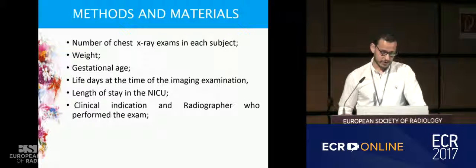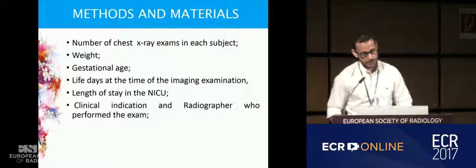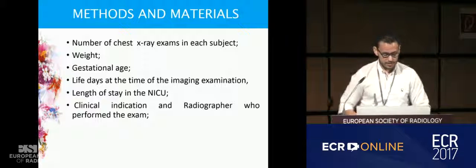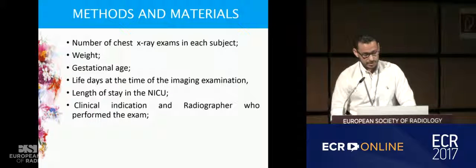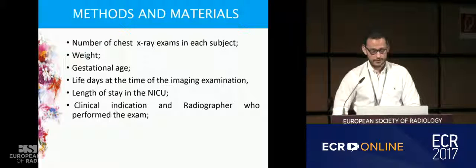We also recorded the number of chest X-rays performed on each subject, the weight of the patient, the gestational age, life days at the time of the imaging examination, how long they stayed in the NICU, and also the clinical indication and the name of the radiographer who performed the exam.